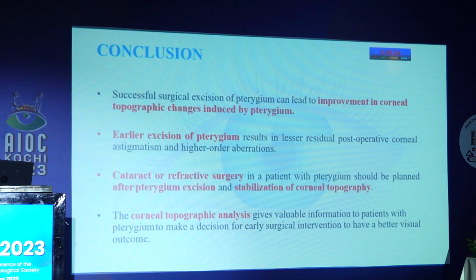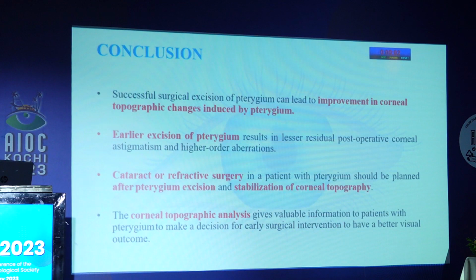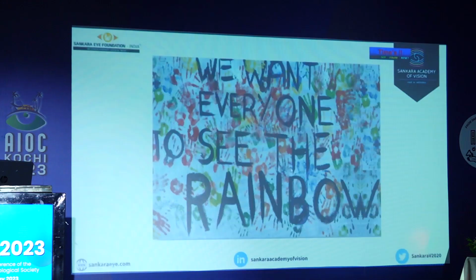The corneal topographic analysis gives valuable information to patients with pterygium, so it should be included in the routine clinical evaluation. Thank you.